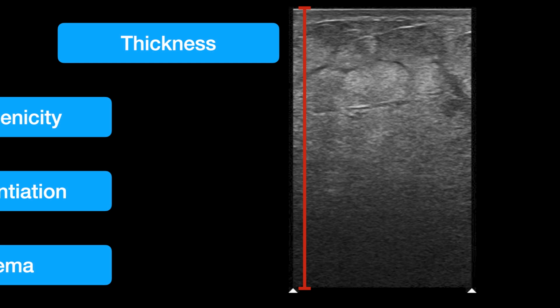And what you'll notice as you do that is that the subcutaneous layer goes from a certain thickness, depending on where you're scanning and who you're scanning. As you get to the inflamed part, it will thicken up a little bit, and as you go back to normal, it'll get thinner again. It'll thin back down to the normal findings that you had on the first side. And so that's the first thing. As you're scanning, take a look at that. You've passed over it a lot of times, I bet, but now that you know to look for it, you'll see that thickening in that subcutaneous layer.